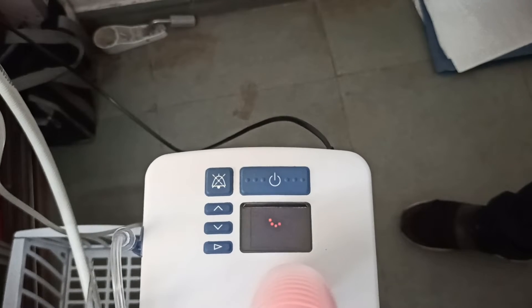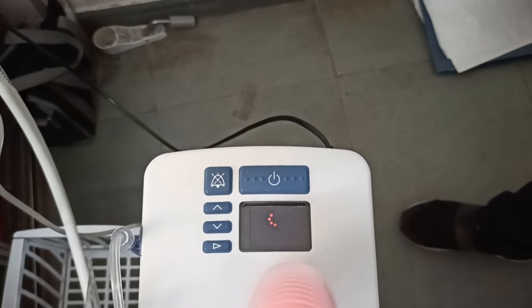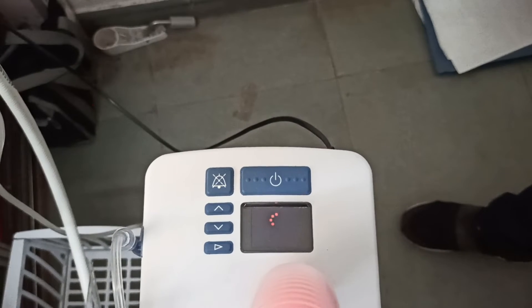It will take at least 45 minutes, so you have to wait for the complete disinfection of the machine.